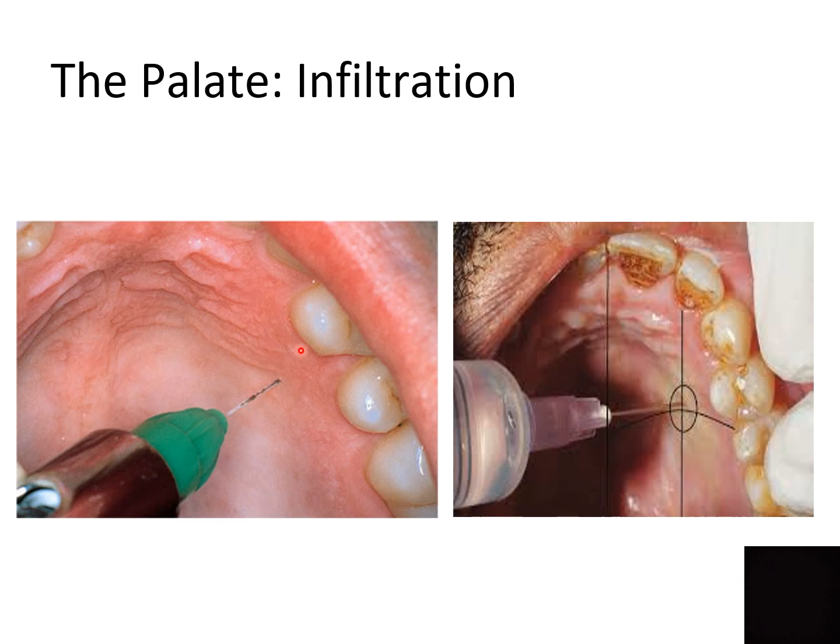So wherever you want to operate, you just need to inject 0.3 to 0.4 mils into the palatal tissues by injecting about a centimeter medial to the marginal gingivae and aiming to be close to the root apex.